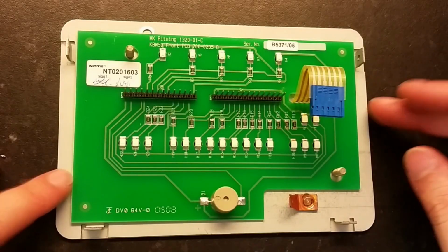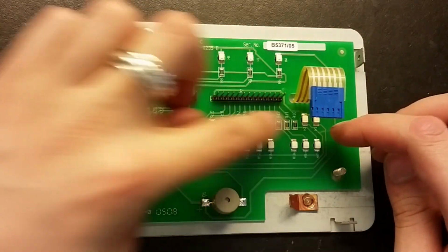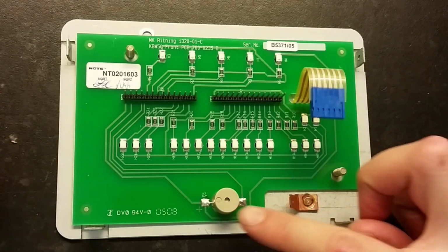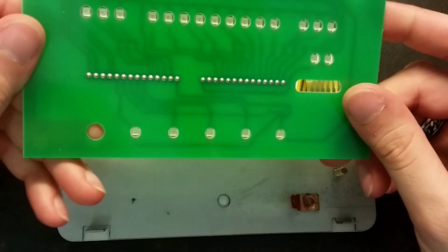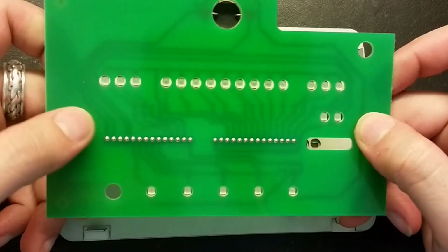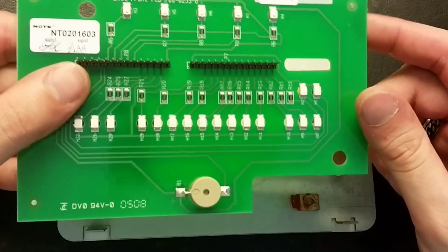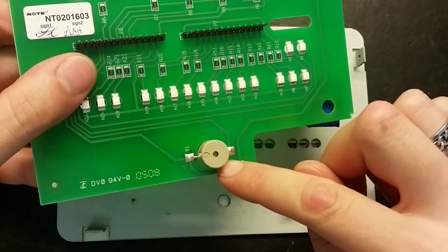Here's a display board. It doesn't contain so much, just a bunch of LEDs and some resistors. This wire goes to the push buttons on the front, got a buzzer. If we flip it around, there is nothing under here. So it's just surface mounted components. And this is actually a through-hole component, but it's soldered on directly here.